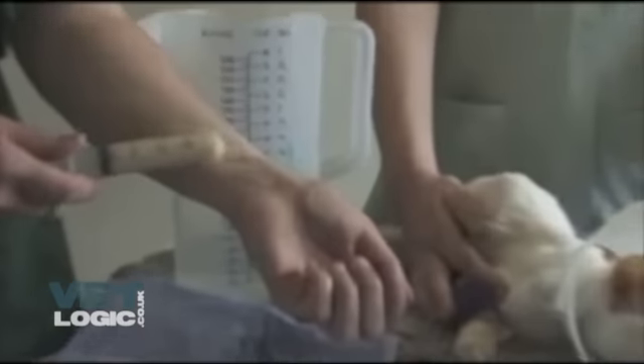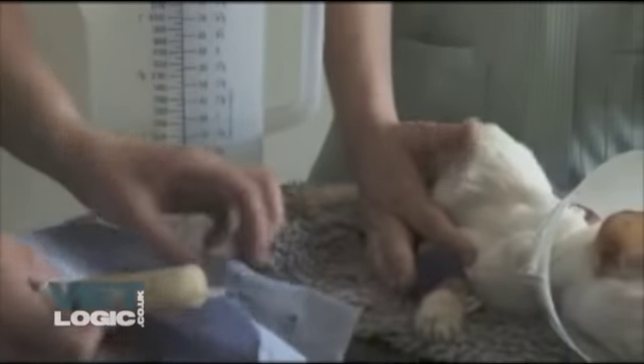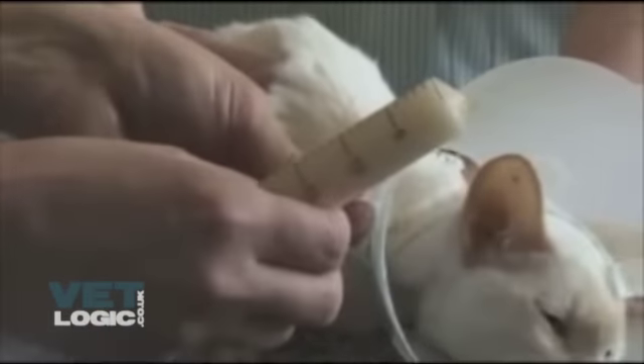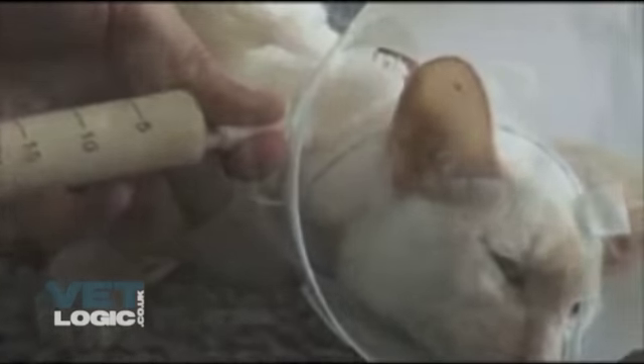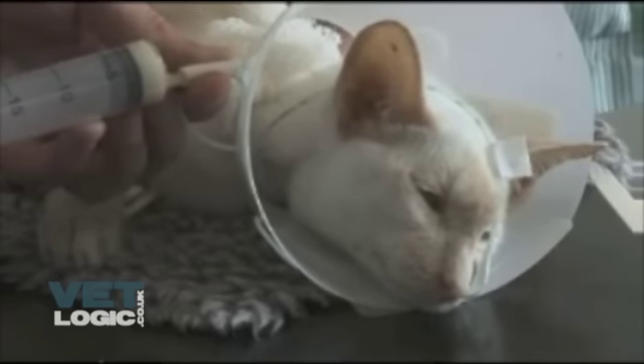When feeding the patient, the food should be prepared as demonstrated in the previous video. Before the patient is fed, it is essential that the tube is checked before each feed to ensure it is still correctly in place, using the checks described after placing the tube. The food can then be administered down the tube slowly to avoid vomiting.